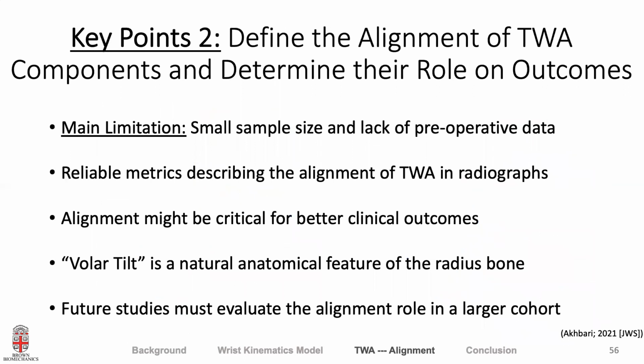So we demonstrated a high degree of accuracy between the manual measurements of the radiographic alignment, and we validated them using a 3D measurement system too. And we only validated our technique for the arthroplasty design we studied, but we believe it is applicable to other designs because they share similar design features.